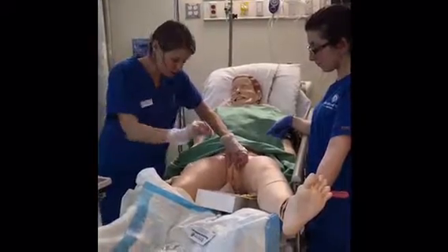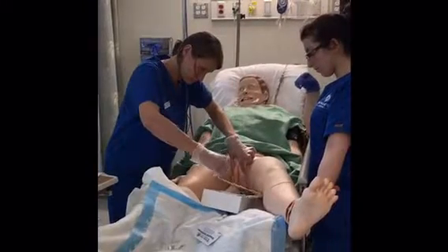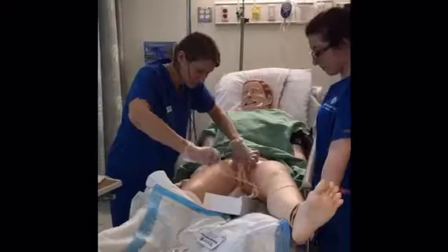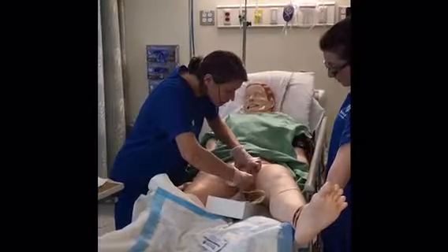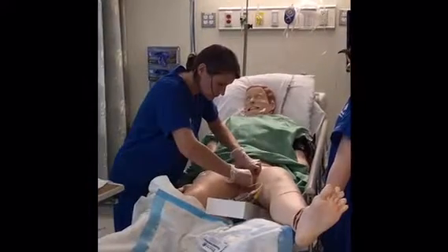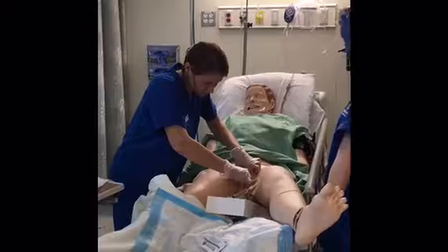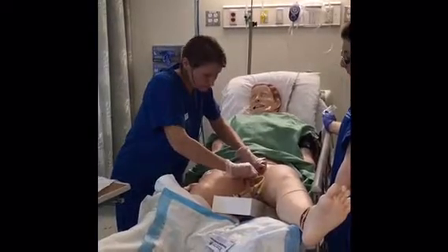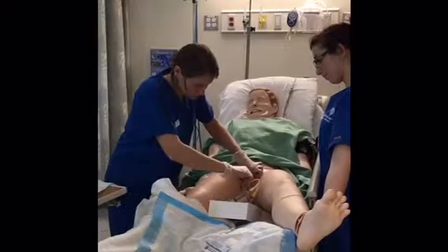Using my sterile hand, I am going to pick up the tip of the catheter. And with my assistant Holly, she will help me pull the lube off. And I am going to start inserting the tip of the catheter into the meatus until I have urine flowing back. Once I see urine, I will then insert it 2 to 3 more inches and then fill the balloon and pull for resistance.